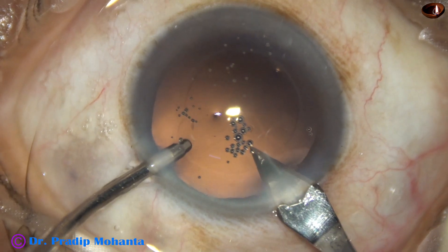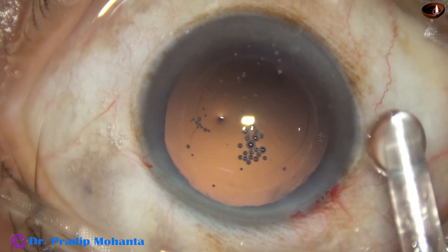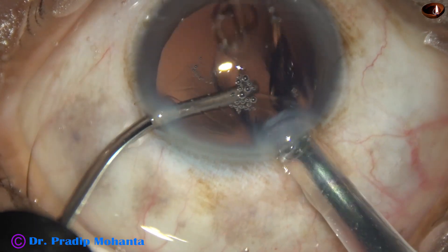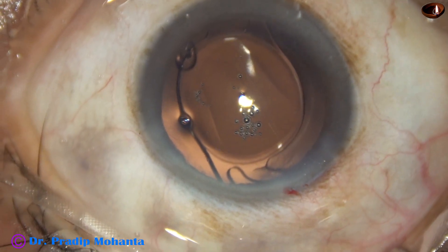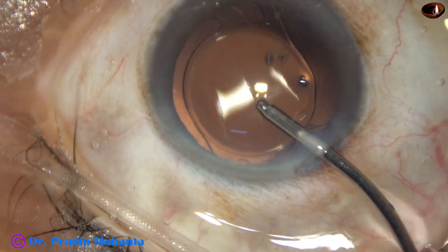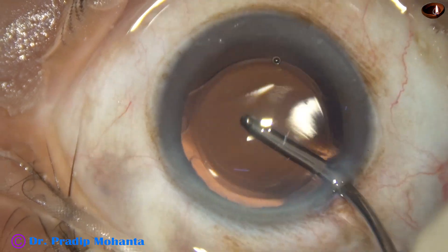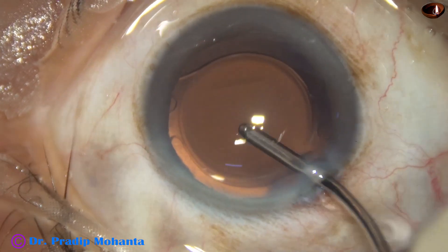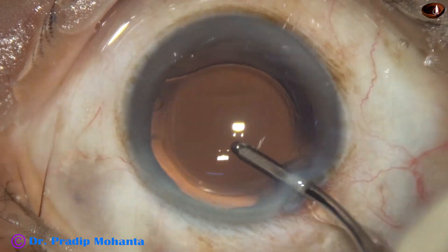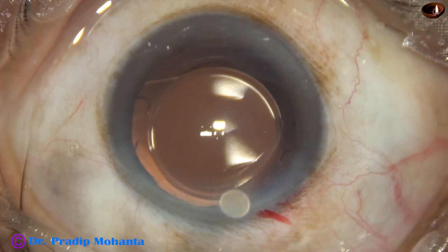Now the main wound is enlarged a little bit — the main wound was 2.8 mm, it is about 3 mm now — and then a single-piece monofocal intraocular lens is implanted in the capsular bag. The irrigating probe is introduced to the main wound and whatever visco was in the lumen of the cartridge comes out. Hydro-implantation saves a lot of time, and since there is no visco, the risk of visco-induced rise of intraocular pressure is eliminated.